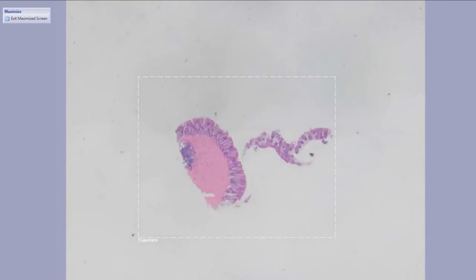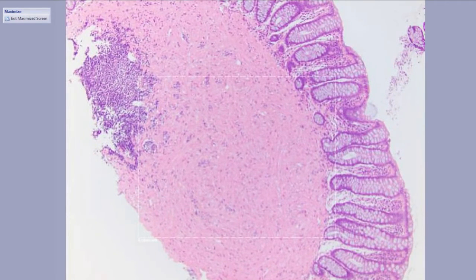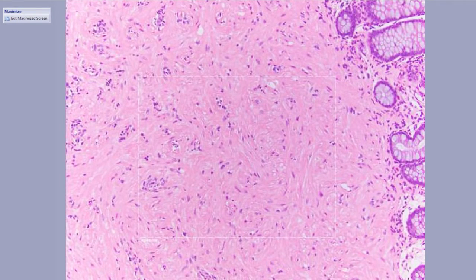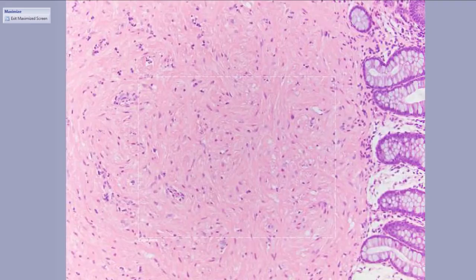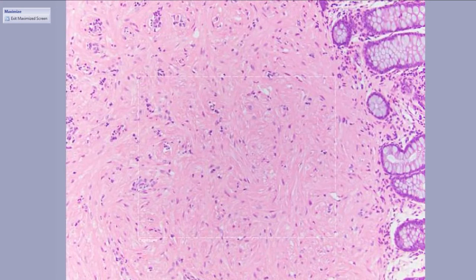Back to more little polyps. Pay no attention to that lymphoid aggregate behind the curtain. I'm showing you a phenomenon that I actually talked about earlier. I mentioned that in the GI tract, leiomyomas are typically small incidental polyps that arise from the muscularis mucosae. This is one of them. This guy is intensely eosinophilic, probably the most pink-looking proliferation that I've shown today. Oops, bumped the slide. Looks vaguely spindled. You can make out the nuclei, but there's not really any atypia, necrosis, or mitoses.